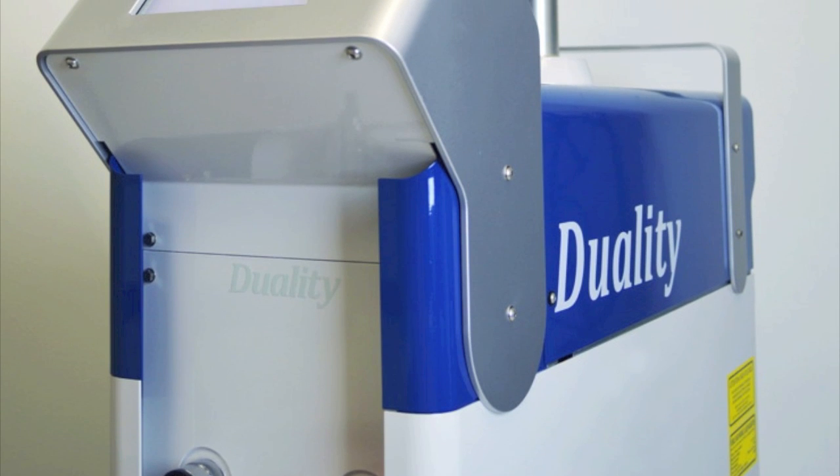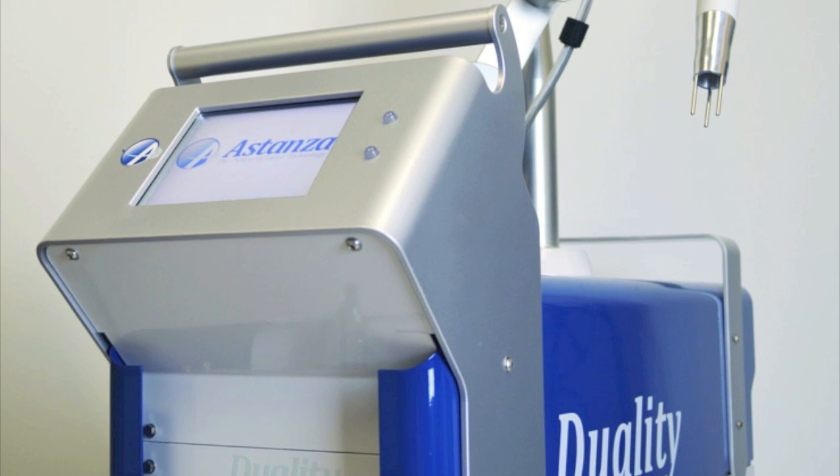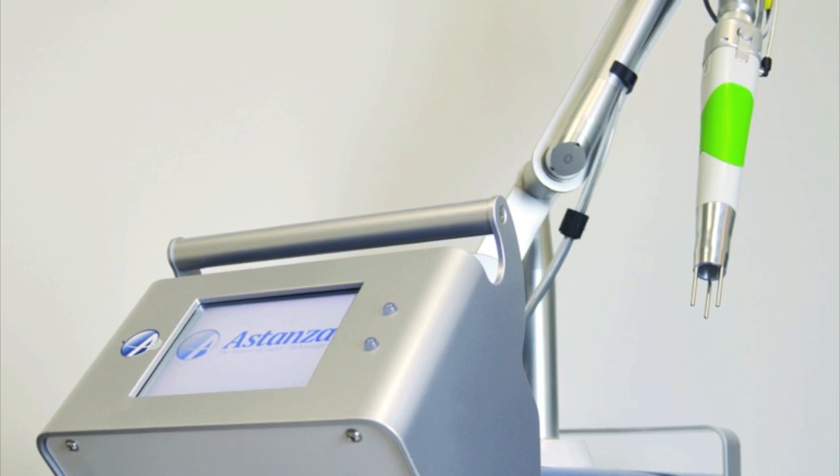Versatile, powerful, effective — the actively Q-switched Astanza Duality is the ultimate choice for achieving impressive results and profiting from the growing demand for laser tattoo removal.